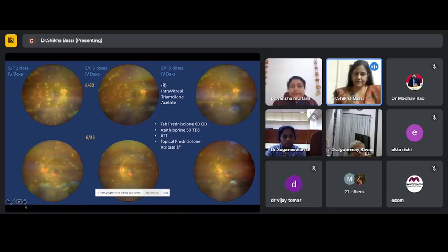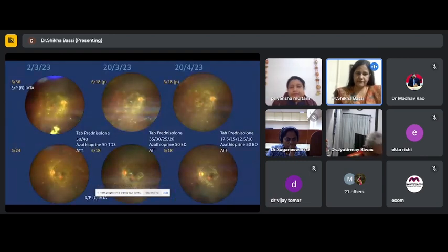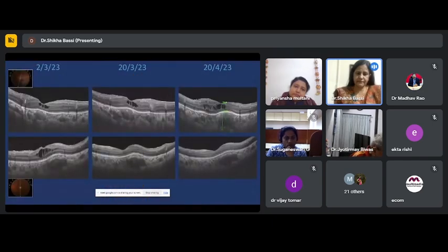Oral steroids along with azathioprine. ATT was continued. OCT revealed some resolution of intraretinal fluid but persistence of the choroidal bumps. On local and systemic steroids along with IMT and ATT, there was resolution of intraretinal lesions in both eyes. However, there was persistence of the deep retinal orangish lesion in the macular regions of both eyes. OCT showed persistence of macular edema in the right eye, but dissolution of edema in the left eye. The choroidal elevations were persistent and quite resilient to treatment in both eyes.